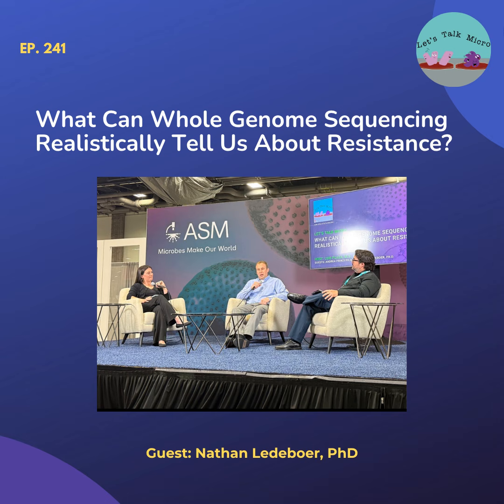In many cases, again, they looked at it compared to cefepime, which is not an easy drug to predict. And they found in many cases upwards of 90, 95% accuracy using the genetic information in order to predict whether that isolate would be phenotypically susceptible or resistant. To me, that was nothing short of amazing. We've seen other studies that have been published since then looking at other drug-bug combinations. There are certainly still bugs that we don't have as good of genetic data on in terms of what's causing the resistance. But that paper, I think, was really nothing short of fantastic in terms of what they were able to show.